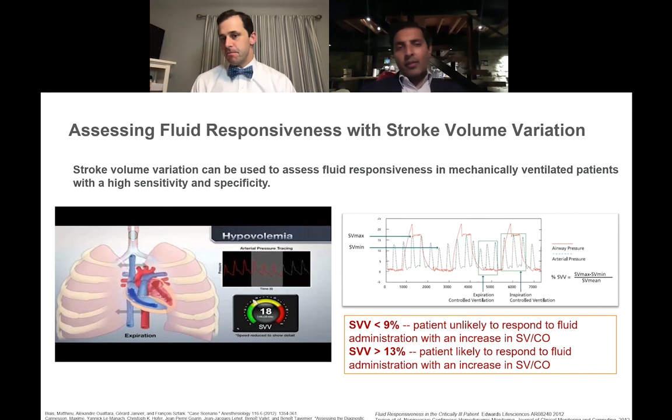I think you're exactly right. We're also creeping into the world of hypotension predictive indices and things that are on the cusp, and we can get into that at a later time. But that variation is really important to track. When you have great variations in stroke volume, that's your ideal patient, and you recognize them clinically as your roller coaster patient, right? That's the one that tends to transition from hypertensive to hypotensive.